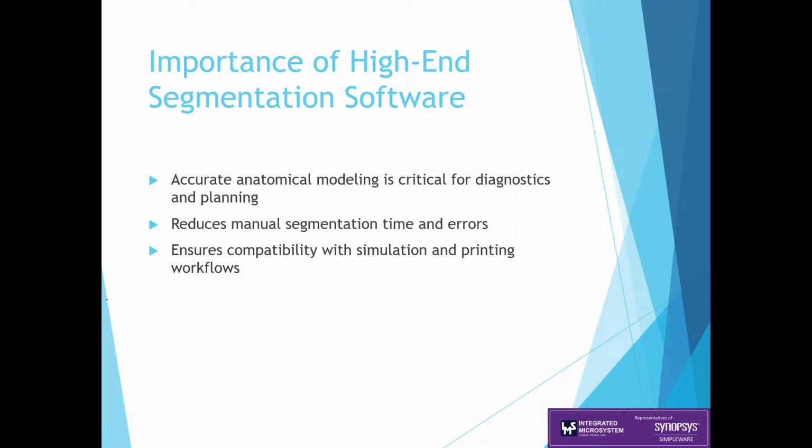Once we are working with such data sets, we can apply various algorithms like the auto segmentation algorithm, which reduces the time. I have such an example in which a heart CT was taken and it took approximately 1.5 to 2 hours to do the manual segmentation, and the same task got completed using auto segmentation in 2 minutes. Although some manual refinements were required, the model was still generated within 15 to 20 minutes. So the time saving you can see is very considerable.